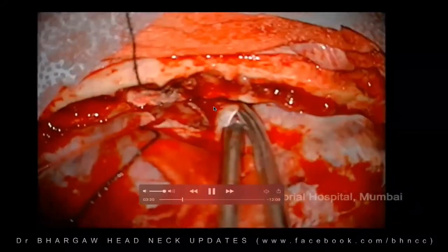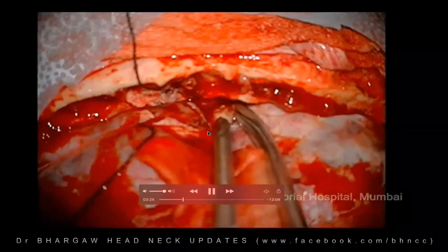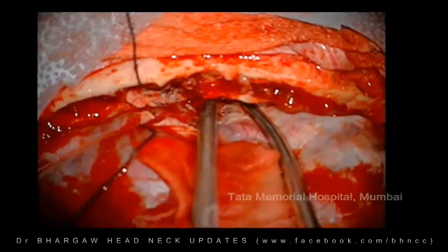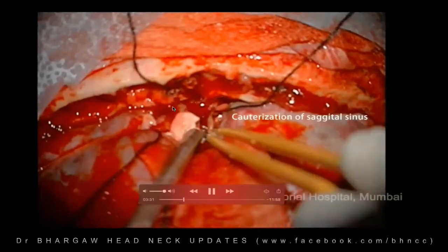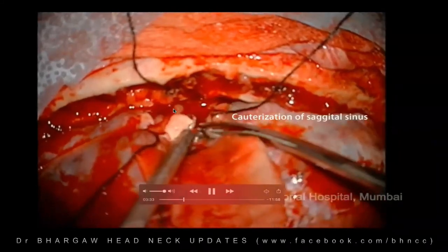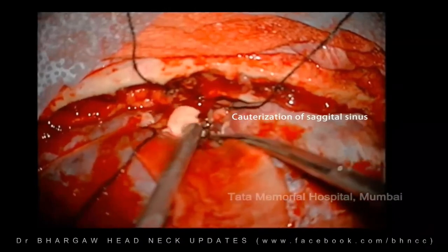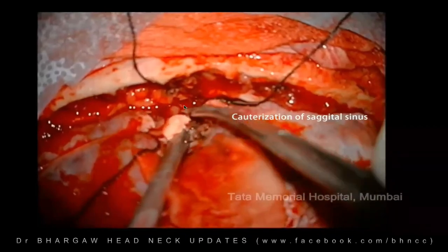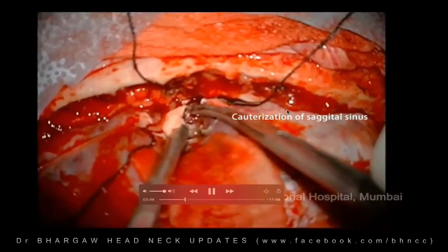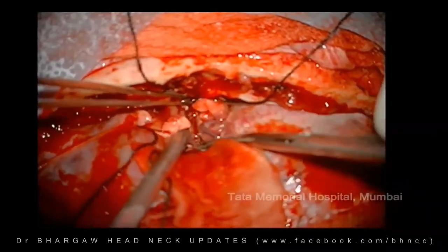And then we are dissecting on the right side, and here you'll have the sagittal sinus coming. Most of our neurosurgeons ligate the sagittal sinus here, and you can see that being bipolared, and they're just cutting it after ligature, and then that will be removed inferiorly, dissected away from the normal parenchyma.